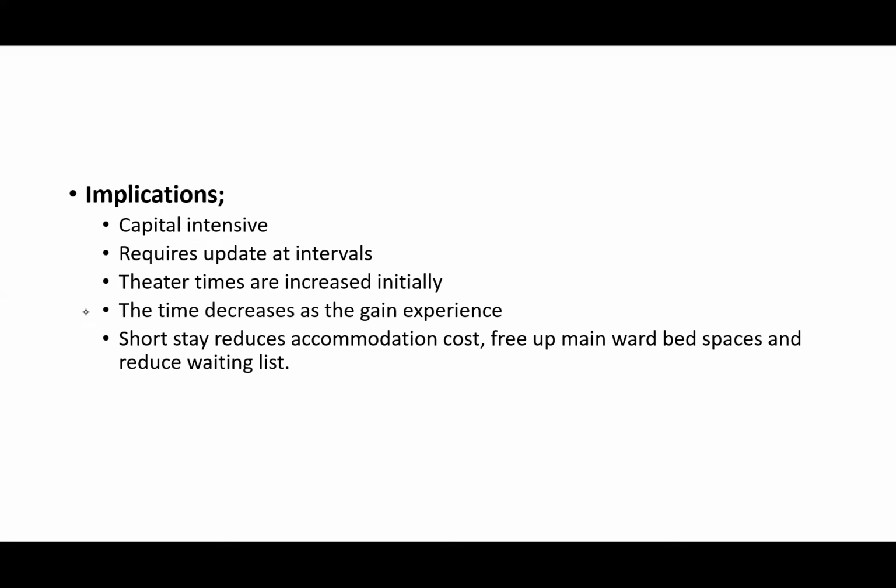Now, theater times are increased initially. Don't be discouraged. When you commence laparoscopic surgery and you start spending 3 hours, 4 hours, 5 hours initially, don't be discouraged. With time, the time decreases as the surgeon gains experience. Now, more so with updates of the instruments that are being used, surgeons tend to become faster.